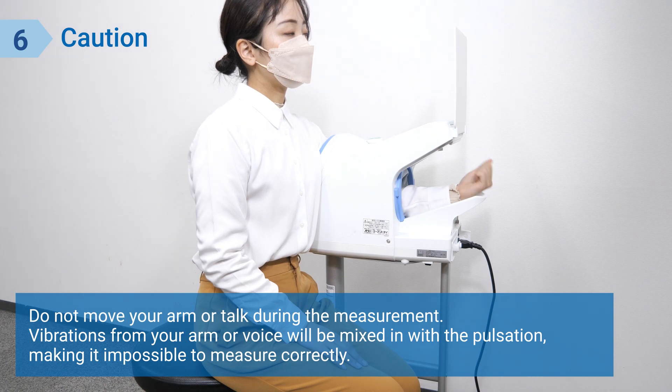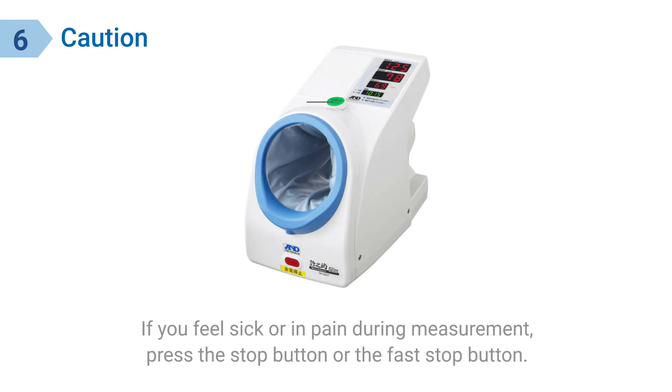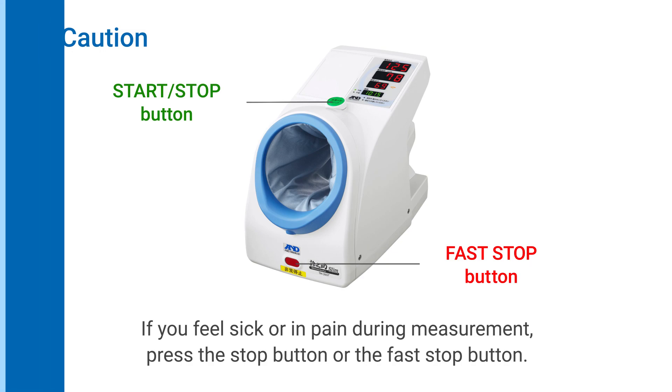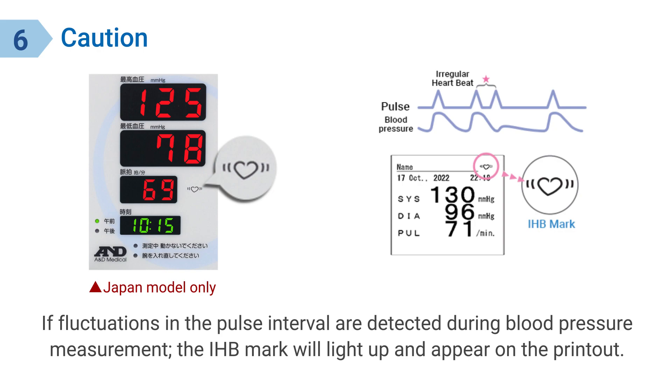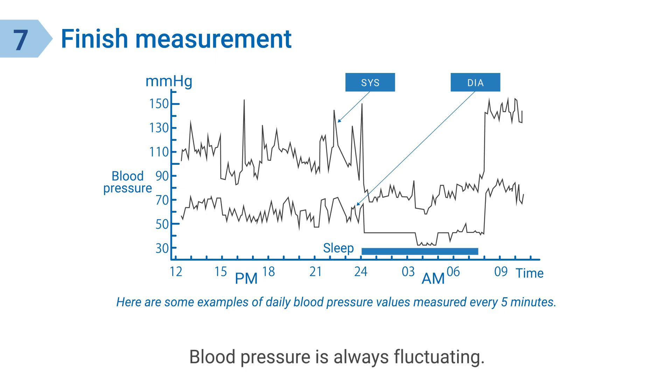Do not move your arm or talk during the measurement. Vibrations from your arm or voice will be mixed in with the pulsation, making it impossible to measure correctly. If you feel sick or in pain during measurement, press the stop button or the fast stop button. If fluctuations in the pulse interval are detected during blood pressure measurement, the IHB mark will light up and appear on the printout. Please rest and take another measurement.